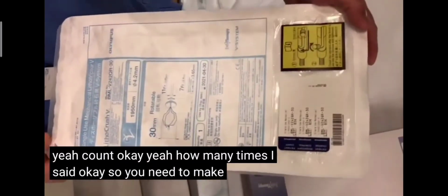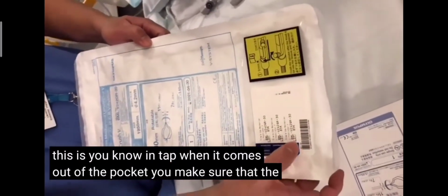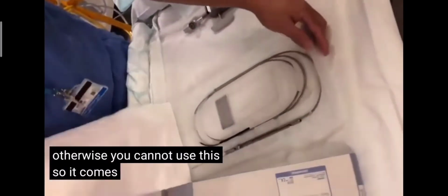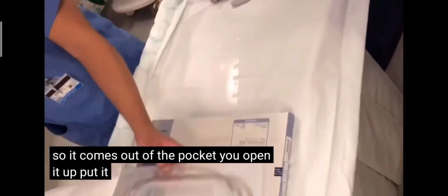You need to make sure that this is intact when it comes out of the pocket. Make sure that the expiry date is within date, otherwise you cannot use this. So it comes out of the pocket, you open it up, put it on the side.